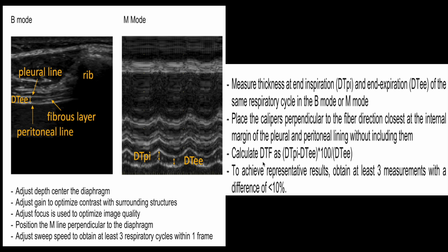Calculate the diaphragm thickening fraction (DTF) as: (inspiratory diameter − expiratory diameter) × 100 ÷ expiratory diameter. To achieve representative results, obtain at least three measurements with a difference of less than 10% between them. Note that here we are measuring the contraction of the muscle rather than its excursion.